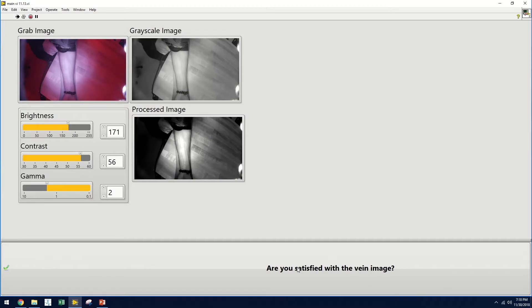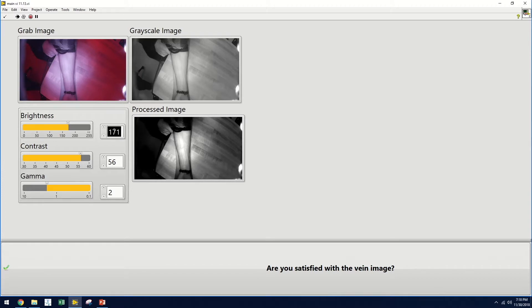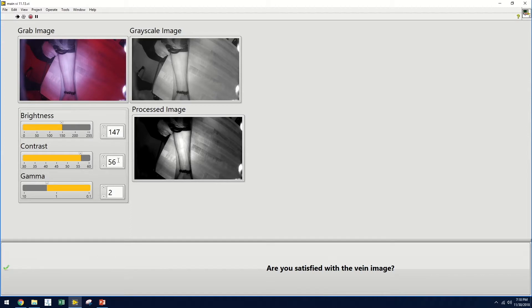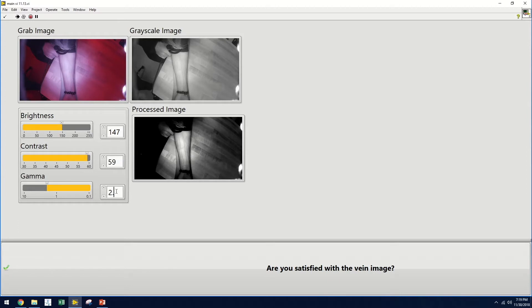Every two seconds, an image is displayed to assist the user in visualizing the patient vein while performing venipuncture. On the top left is the original image. On the top right is the grayscale version. And on the bottom right is a processed image, where the user can adjust features such as brightness, contrast, and gamma.